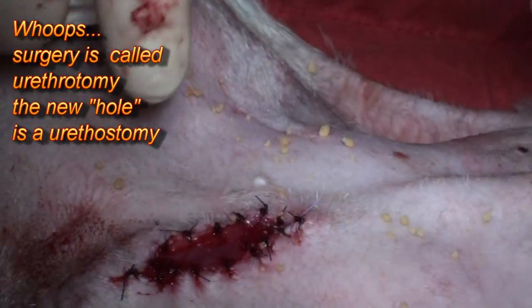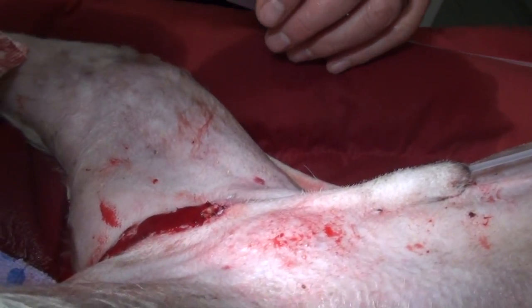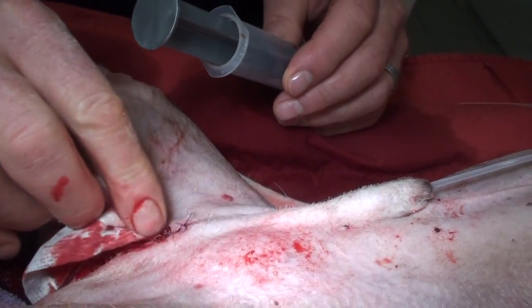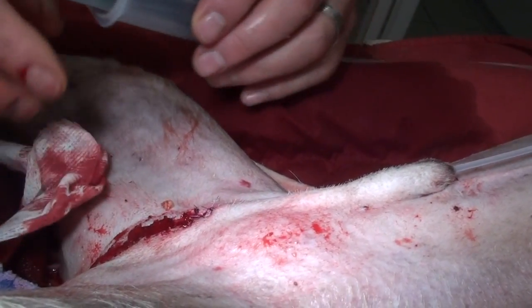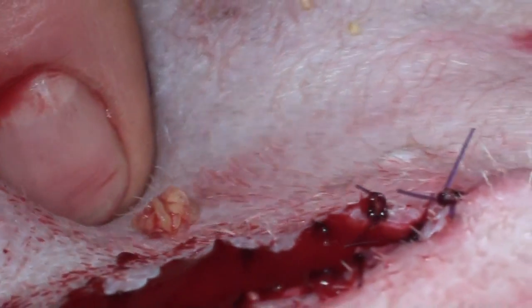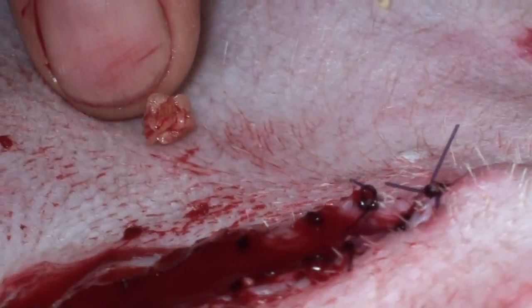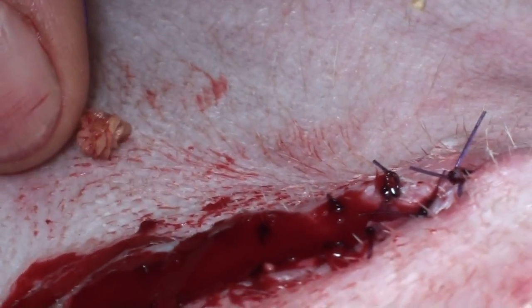Here's all the little crystals — here are the stones. It looks like the crystal that caused all the plugging is this one right here. Look at how pretty that looks — it even looks like a cave, like a stalactite with a whole bunch of growth on there. We'll look at that under the microscope. This is a pretty big crystal I removed from right near the os-penis, and it came back as calcium oxalate. You can see how jagged it is.